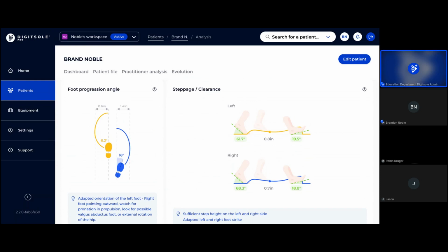So there's potentially a little bit going on both of these sides, and that's why again, the history is important, because maybe some of the deviations on one side could be because of the problem that we see on the other side.